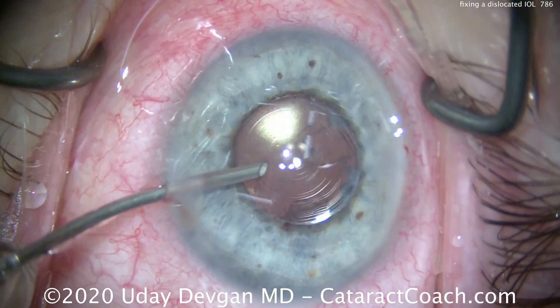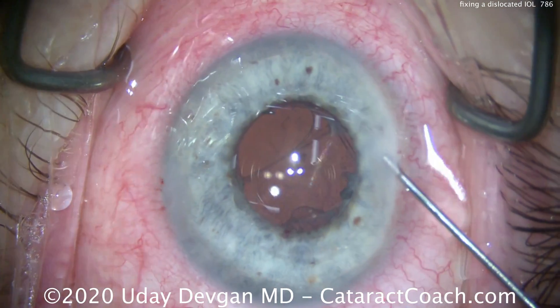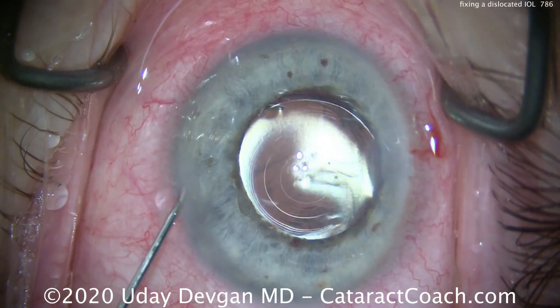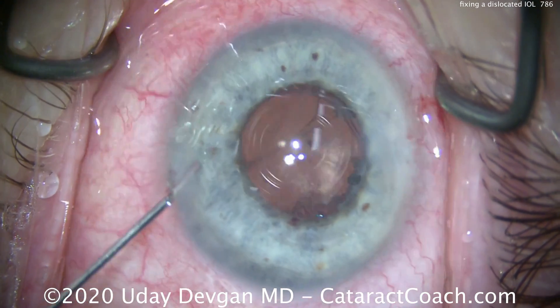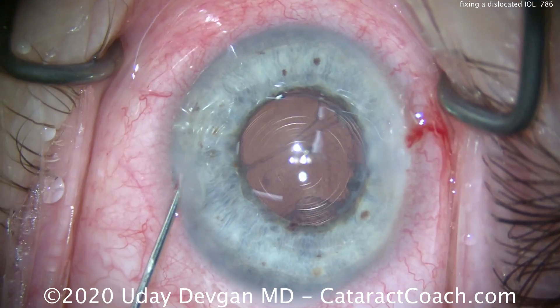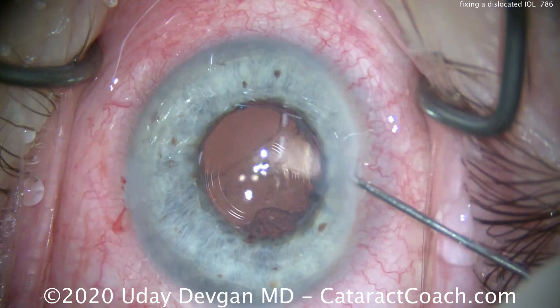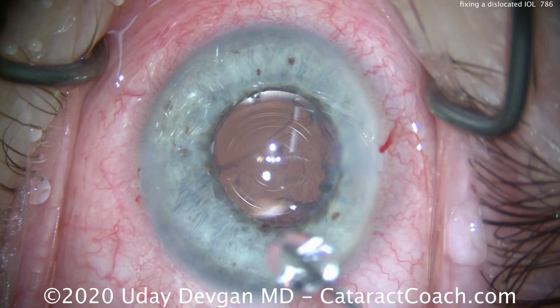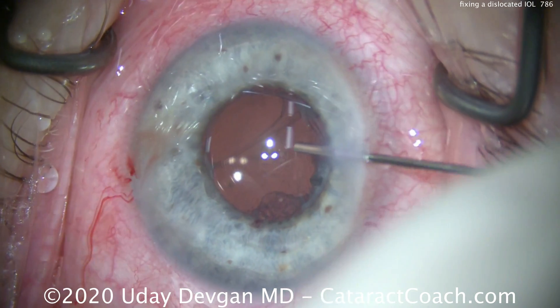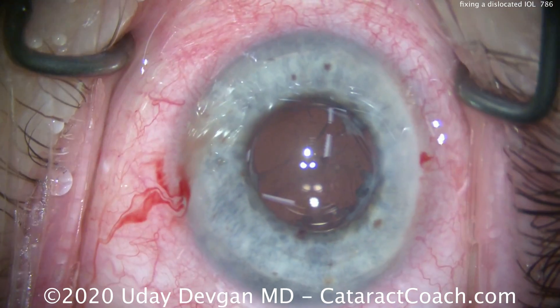What are the options for holding this lens? You can leave it in the sulcus, or try to capture the optic behind the existing capsulorrhexis edge or even a posterior capsular opening. In this case, we're going to leave the lens in the sulcus and get it partially tucked underneath the rhexis edge. There's a little fibrotic material outside the visual axis, but we want to preserve as much support as we can — we can always do a YAG capsulotomy later.